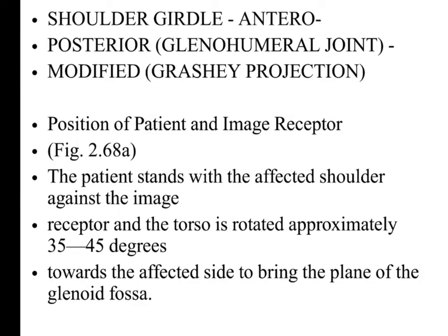Shoulder girdle, anteroposterior glenohumeral joint, modified Grashey projection. Position of patient and image receptor.